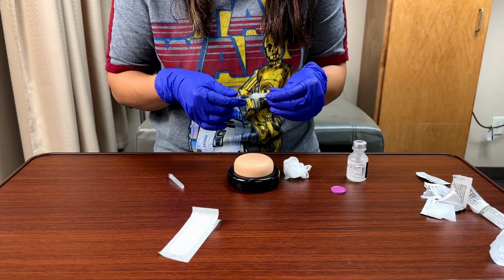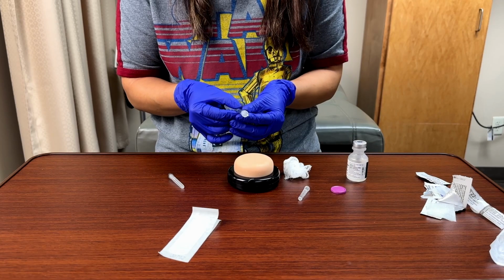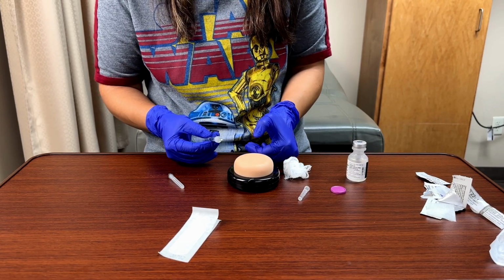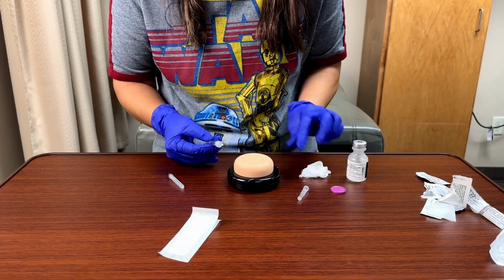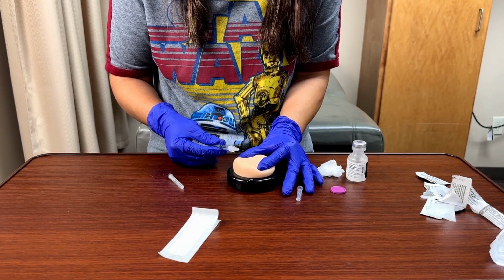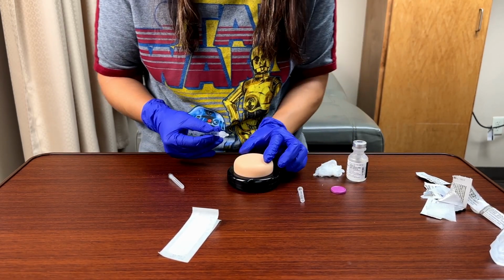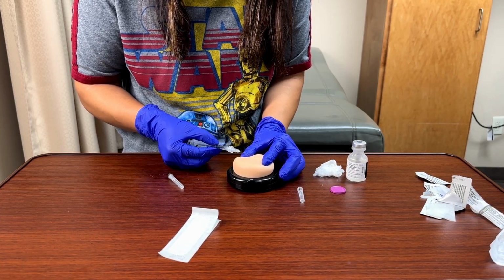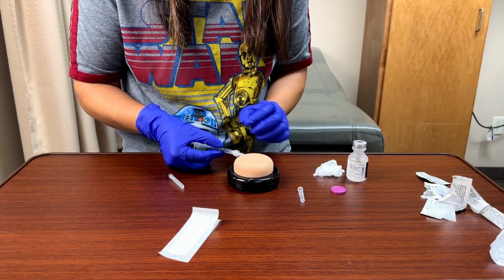So we want to open it up and we want to find our bevel. My bevel is right here. My bevel is going to be up. Now for this one, we do need to pull the skin taut. So we're going to kind of use our thumb to pull the skin tight, or you can use both the thumb and index finger. So I'm going to do that. I want to make sure you can see. So I want to pull it tight, and I'm going to insert the needle just underneath the skin, okay?